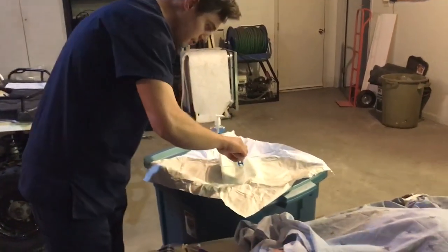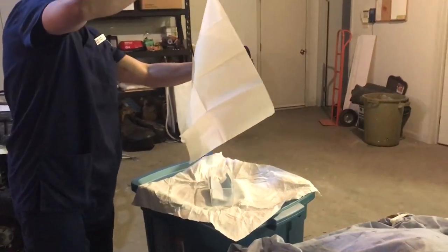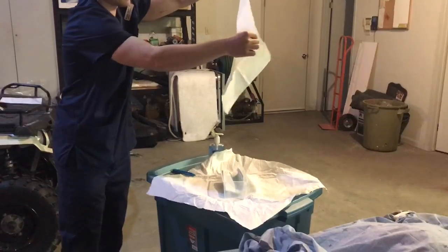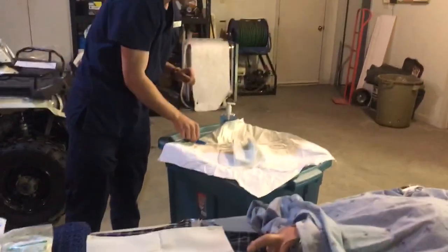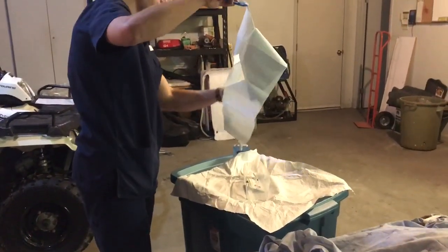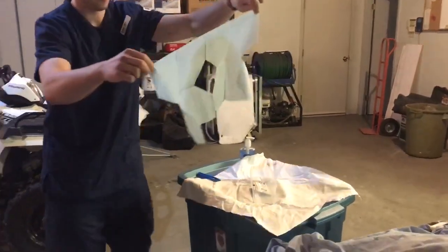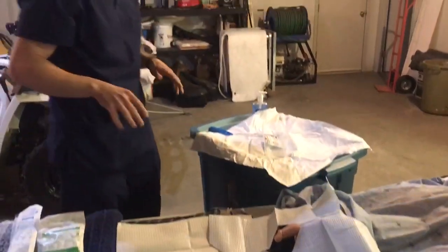Next, I'm going to open up our sterile drape, making sure only to hold in the 1-inch border there. And I will put that between the patient's legs, like so. Now I'm going to open up the fenestrated drape, hold in the 1-inch border again, and place that over the genitalia like that.